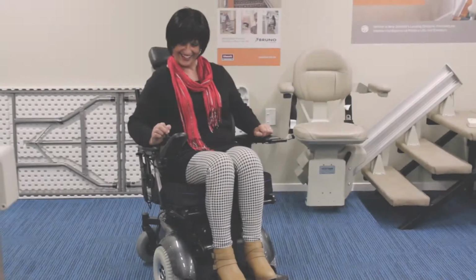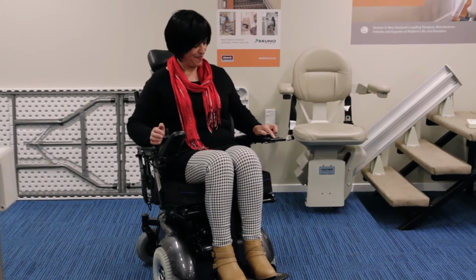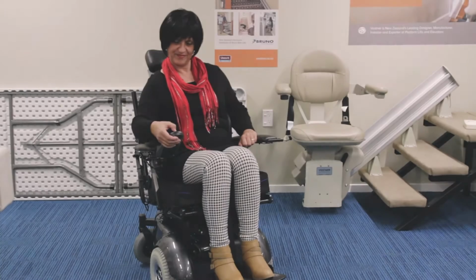One thing to check first is that the seating is obviously sorted and that the person has a stable position in the chair, particularly if you're using switching. So if the seating's not ideal or they're struggling to maintain a good position in the chair, typically some of our people with high tone, the cushion's had its day and needs to be reviewed and they're sliding forward on the seat, it's best to get that sorted before you look at this.